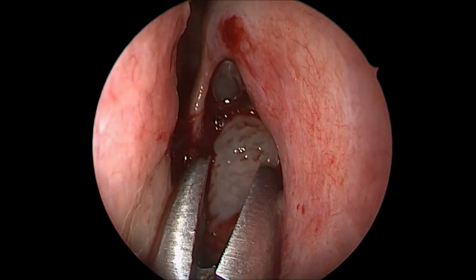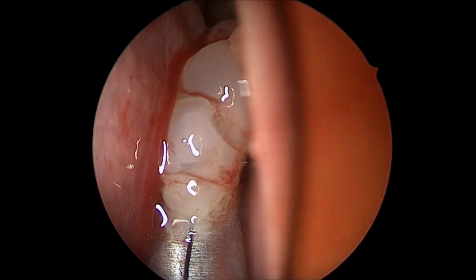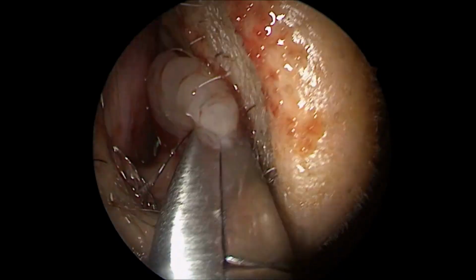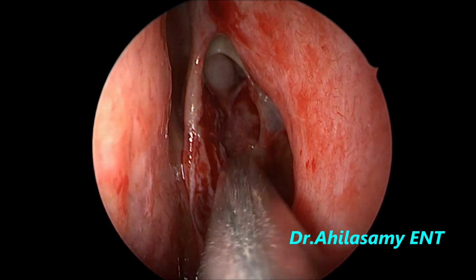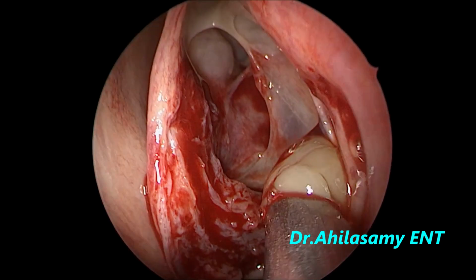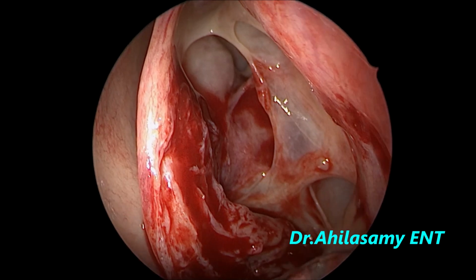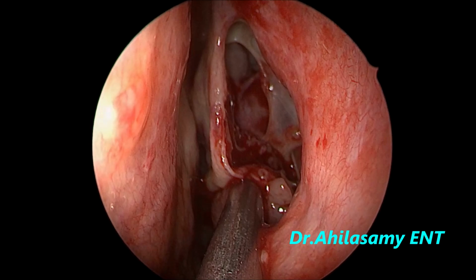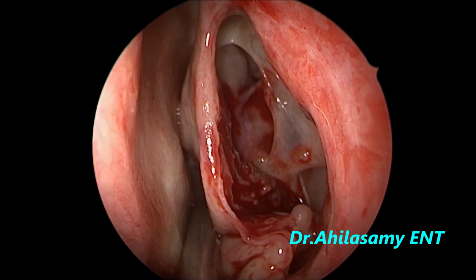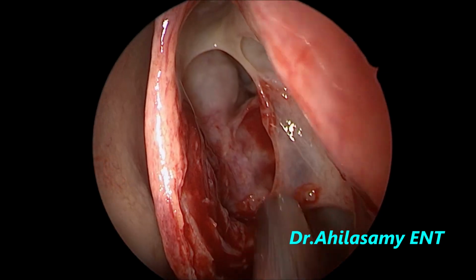So a big chunk has already been removed. So another piece of that papillomatous mass is being taken out. Patient is very cooperative under local anesthesia. Now the middle meatus has cleared and the anterior also has cleared. You can see a lot of secretions from the maxillary sinus, thick mucus secretions because of the obstruction by the papillomatous tissue, have been sucked out.